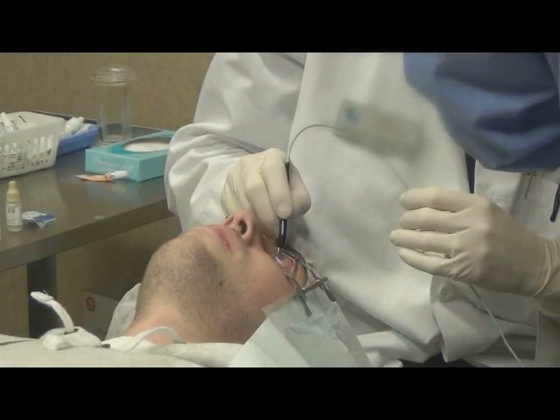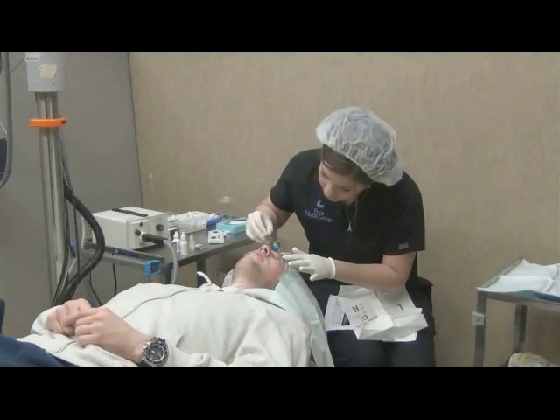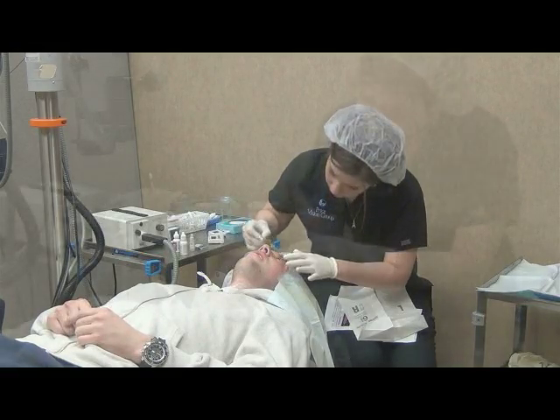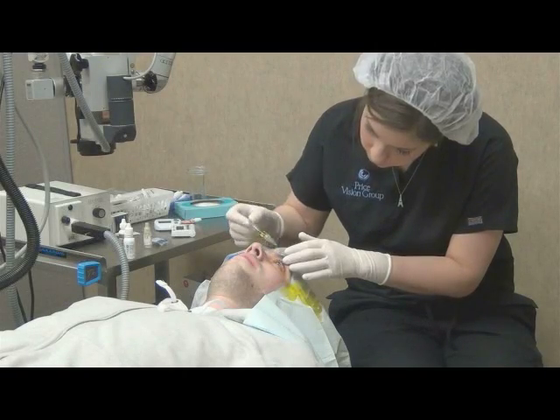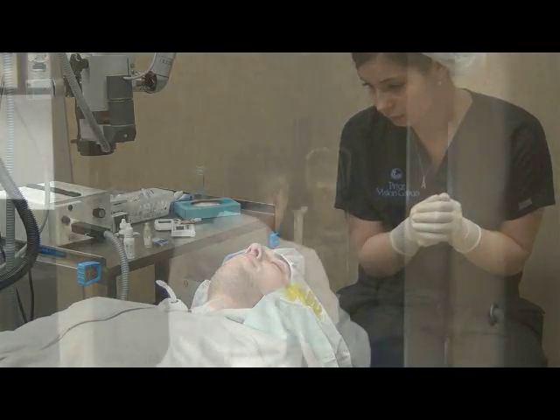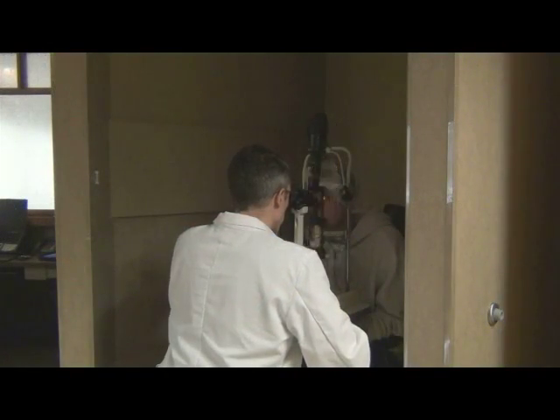Riboflavin, or vitamin B2, is yellow — it's actually used as a yellow dye in some food. We'll drip this on the eye until the cornea is totally soaked from the front to the back. Once we have a good dosing of the riboflavin, we'll check the eye with the slit lamp, a special microscope used to examine the eye, and make sure it has penetrated completely throughout the cornea.